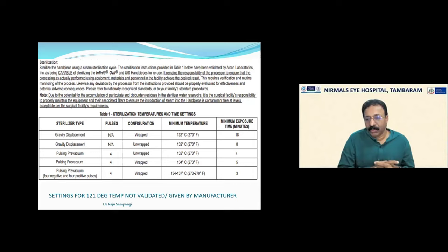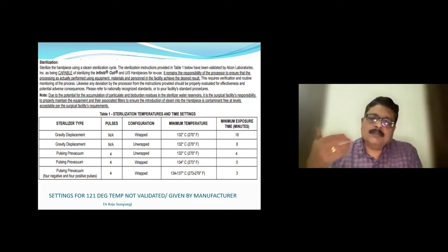When people enter so many numbers on a regular basis, there can be some errors. So when you have this automated printout, it's not people dependent, it's machine dependent. Yeah. What I would suggest is if you have the budget, go for the best documentation method you can get.